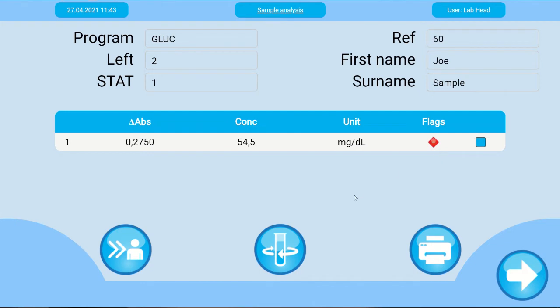It is possible to directly rerun this sample by pressing the repeat button in the software. Press the print button to create a printout of the result.